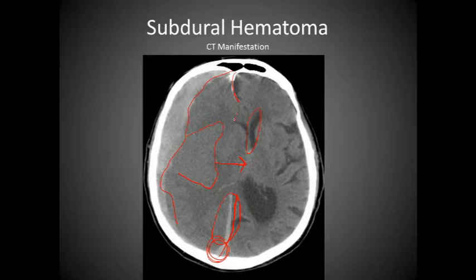And so we have compression of the right lateral ventricle, as well as associated shift of the occipital horn of the lateral ventricle. And because of this intracranial pressure, many times the patient will be treated by cutting out a portion of the skull, maybe here to here, and removing it, allowing the pressure to escape, and then once the pressure is down, reattaching the patient's skull. So very, very dangerous points here with such a midline shift.